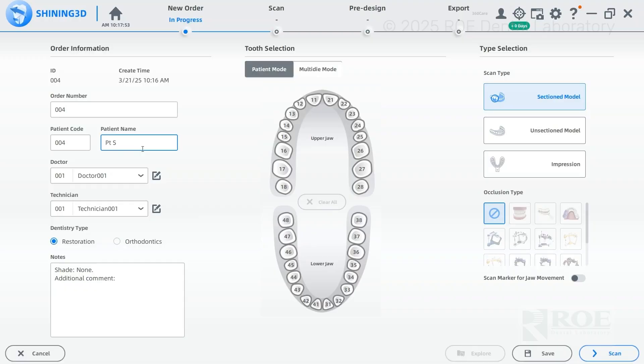Type in the patient name — for example, 'Smith.' If we're going to be fabricating the dentures, you're good to go and start the order. But if you're just scanning to keep it on file for study or scan only, you want to type 'scan only' after the name. That way we do not fabricate anything for this patient's case.